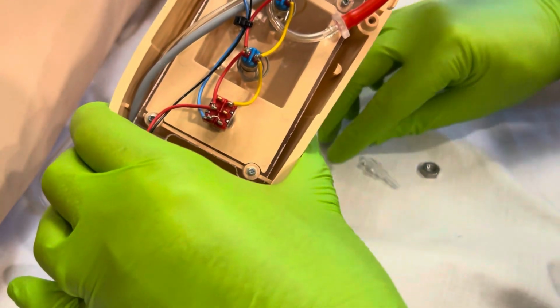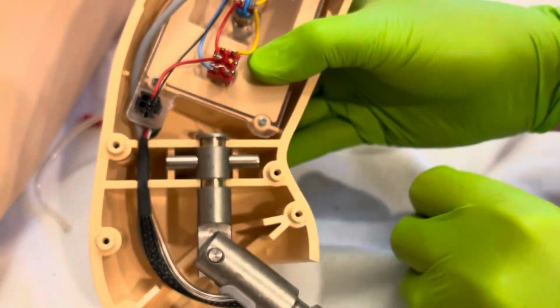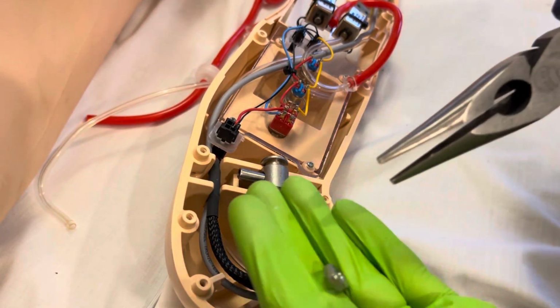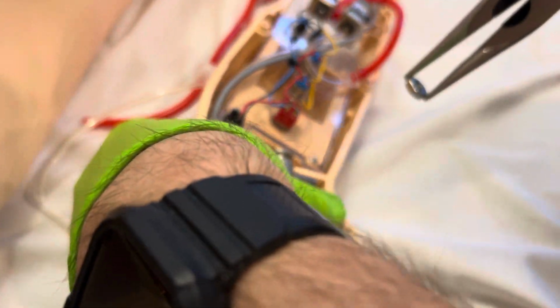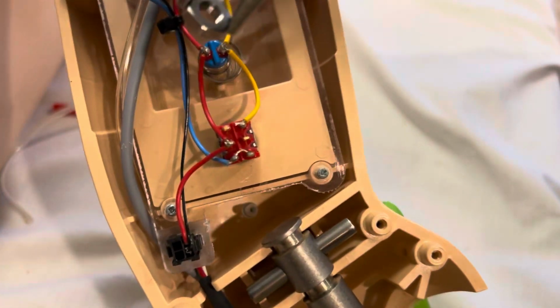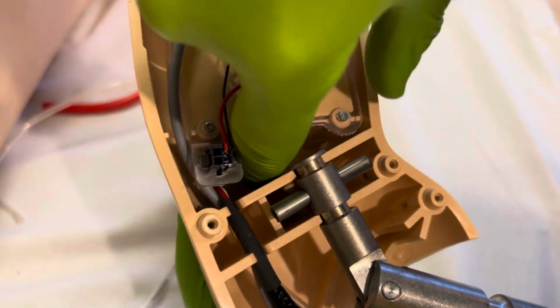All right, now I'm going to replace this connection point, send it through there. This bolt that holds it on, it's kind of hard to feel it to get down in there with the needle nose, so I use the needle nose just to get it onto this contact point. It's always hard to do any job with one hand. Okay, make sure it's evenly on there.